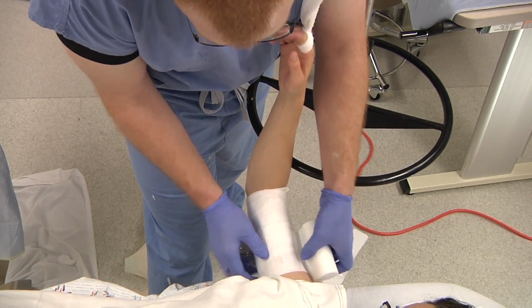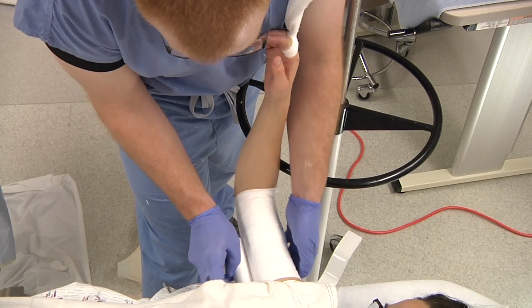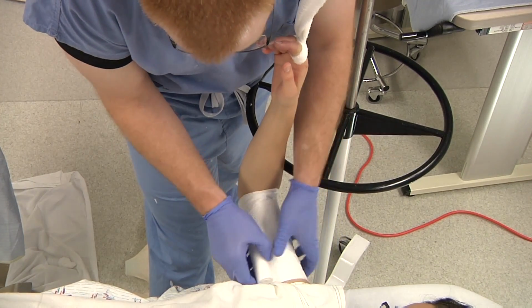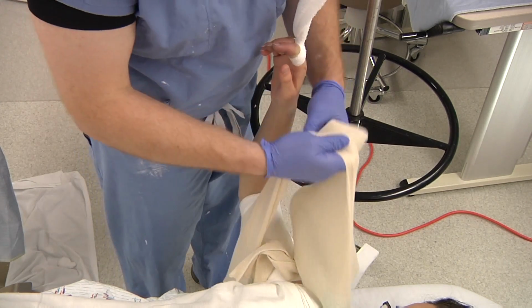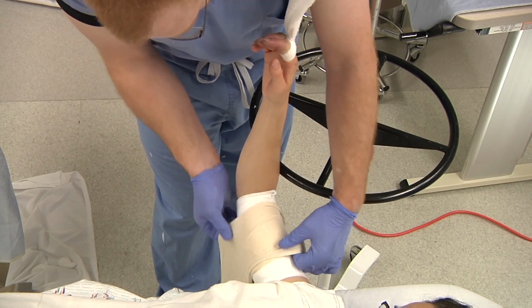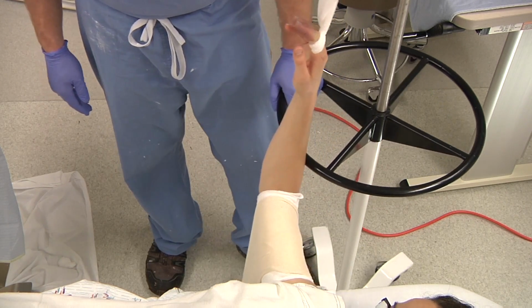Always make sure that you have a minimum of 4 layers at the top and bottoms of your splint. From there, it's easy to apply your traction. It's nice to have a broad surface and let that hang. And it's already padded, so we'll be able to cut that off easily.